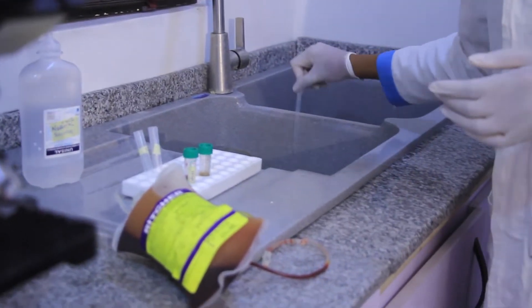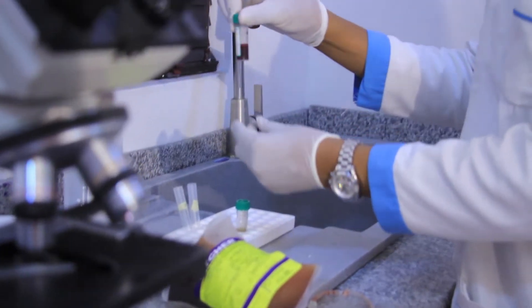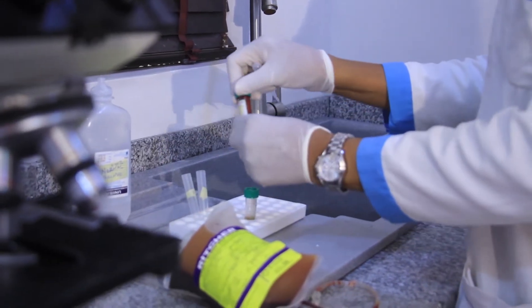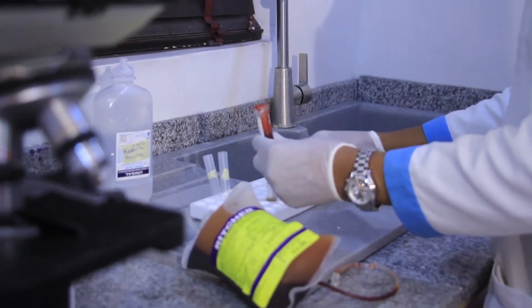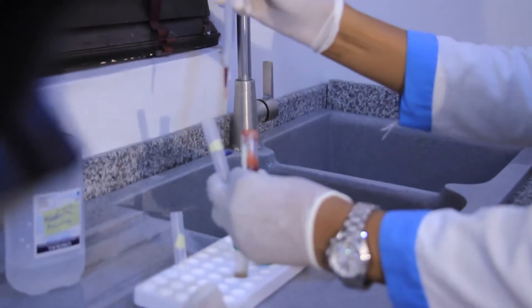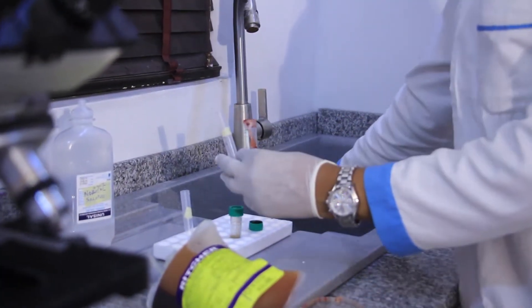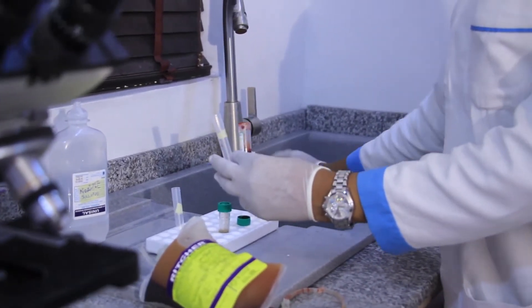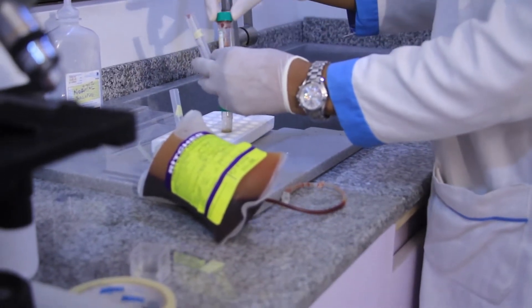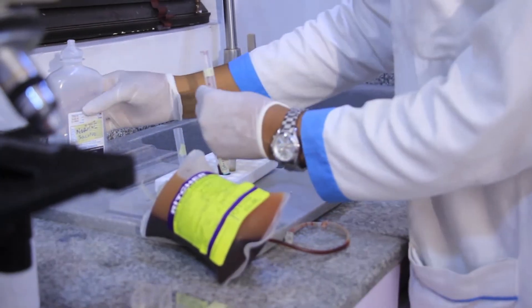We're going to pipette normal saline onto the donor's red blood cells. Mix it properly 5 times and gently open. Then we pick 2 drops of the blood cells — that's all. 2 drops, then cover this. The last thing is to add normal saline.